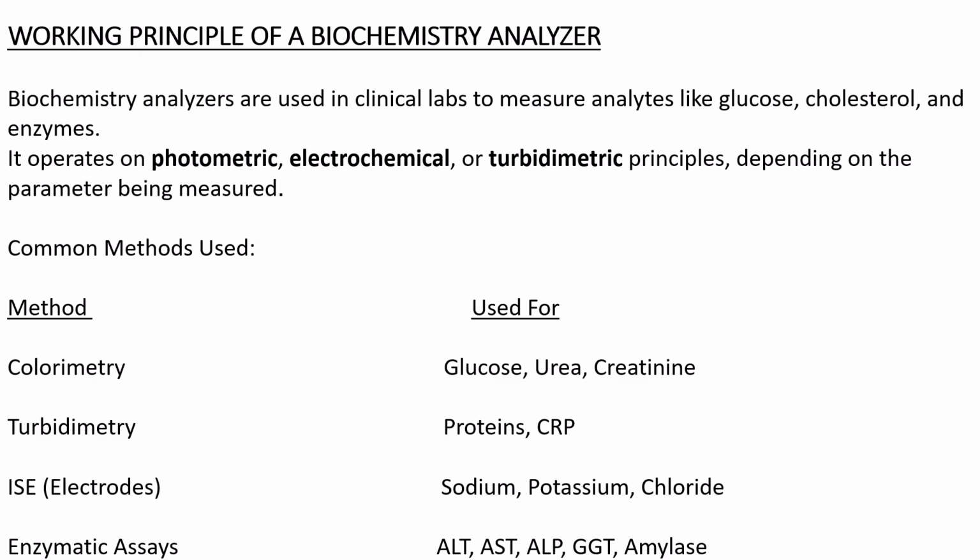Then we have enzymatic assays. The enzyme will catalyze a reaction and form a measurable product. For example, urease will break urea into ammonia, and we measure the ammonia, by which we will understand how much urea is there.